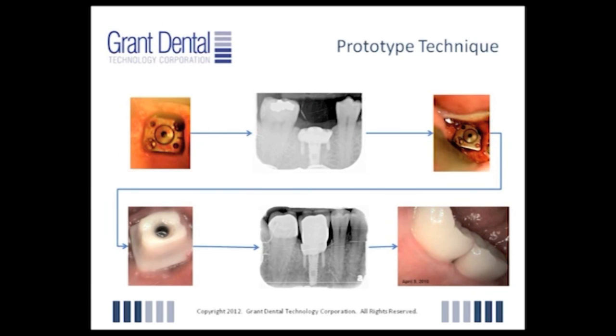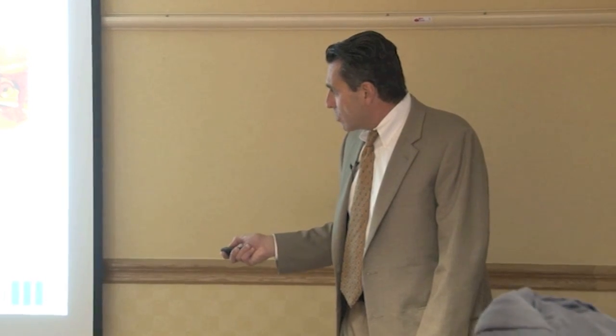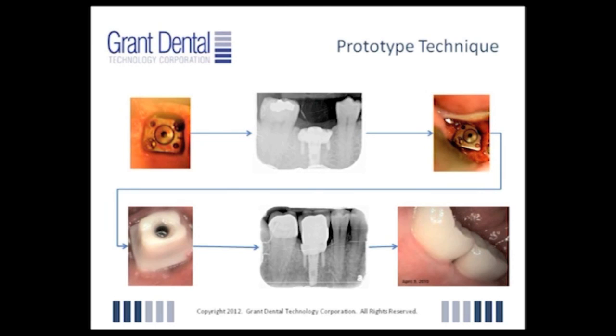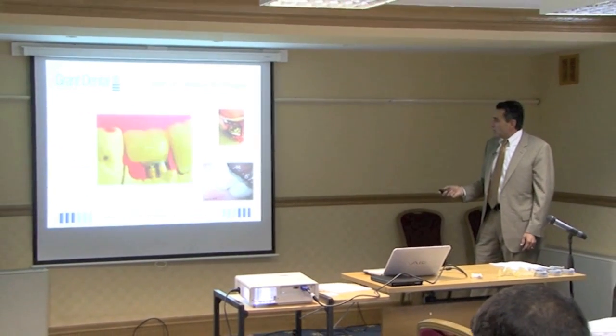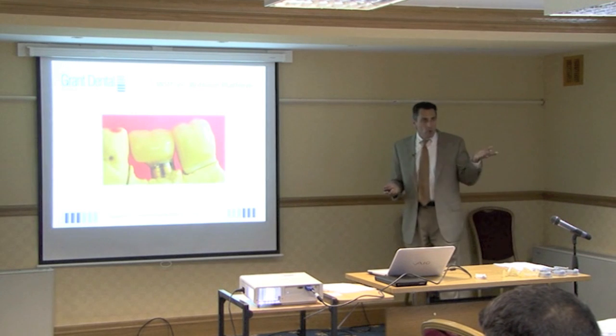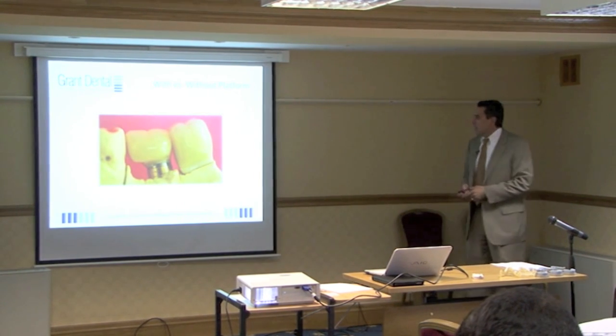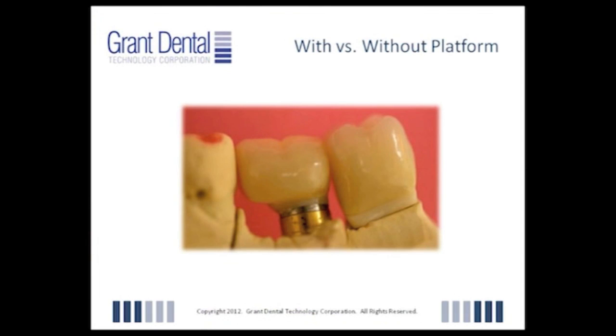So we eliminated a lot of this embrasure space by coming from the bone and coming up. And this is what it would look like clinically restored. Now, what Jim was talking about before, we did 10 implants in 8 patients, and we followed them along. And this was our prototype. And what we learned from that is, to date, I've taken out 4, but after 2 years, they lasted and functioned for 2 years.